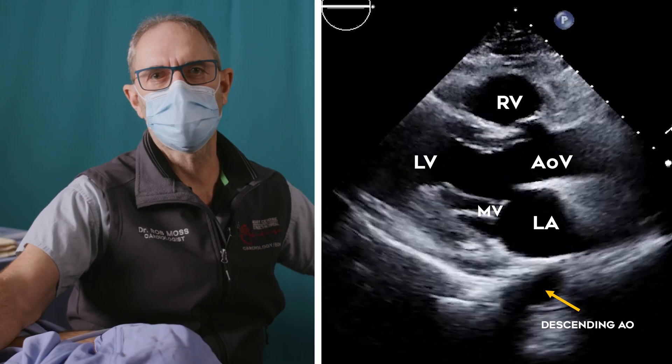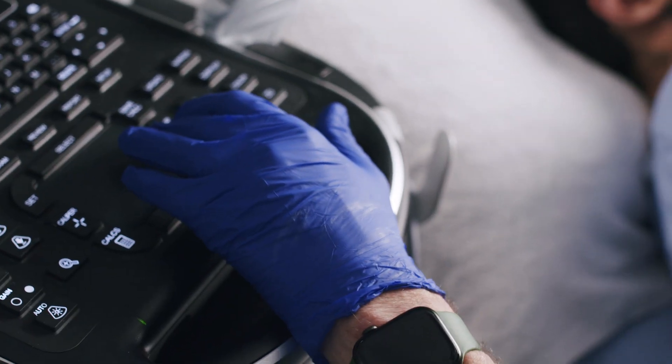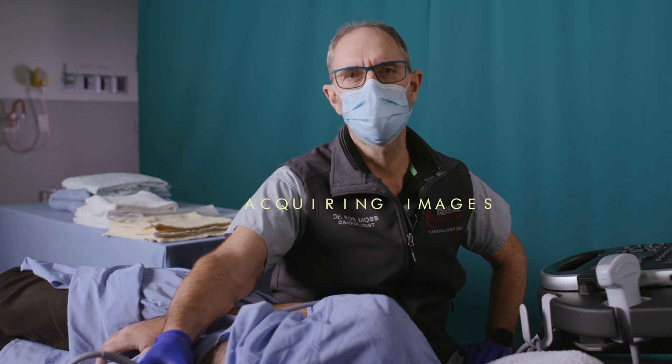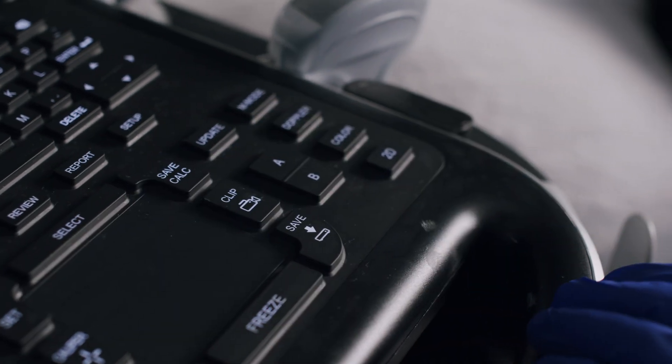Next, I usually adjust the gain setting so that the blood pool is fairly black but I can still see endocardial structures such as valves and endocardium. Once my image is optimized, I acquire the image — meaning recording either a still frame or video loop. Most focus units, unlike conventional echo machines, are preset to record a clip of a certain time duration, usually two seconds, though this can be customized in the unit sub-settings. There may be situations when we wish to record a greater number of beats over an interval of time.